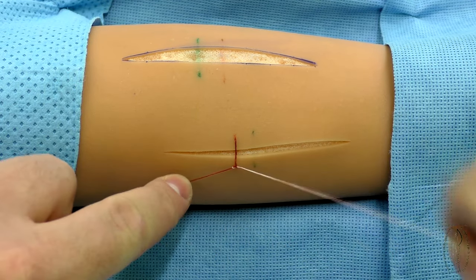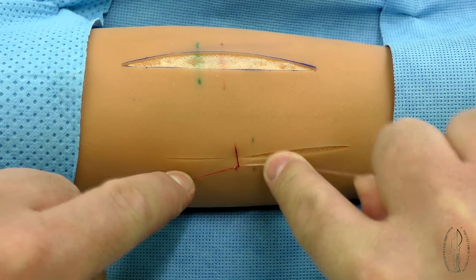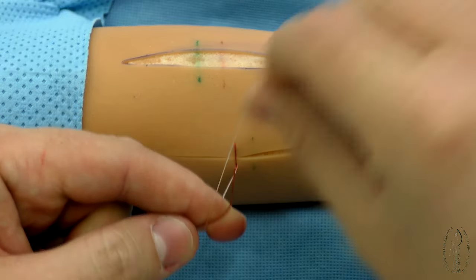The loop is tightened. Further, the second loop and the third loop, as appropriate, are formed and tightened.